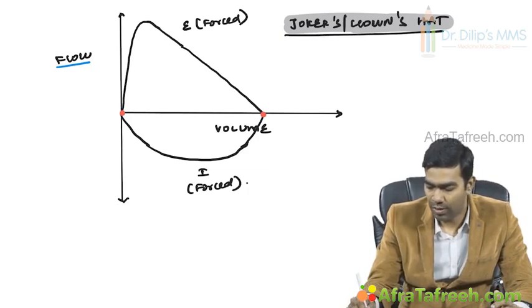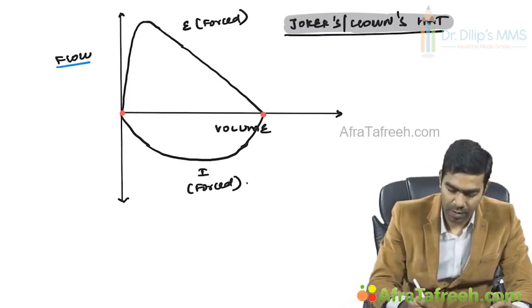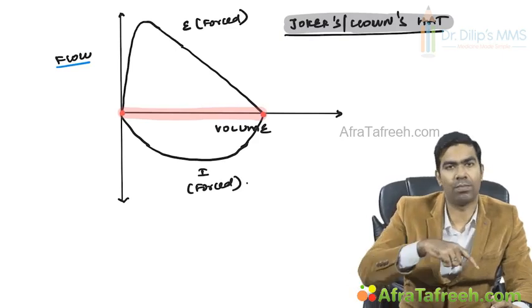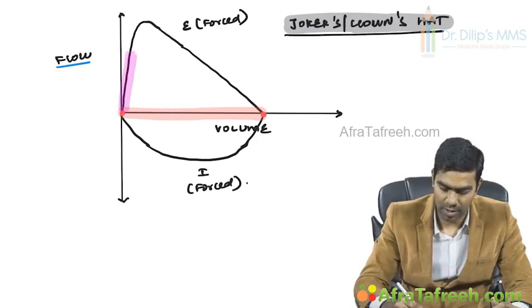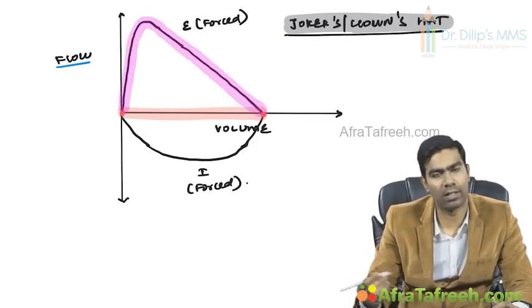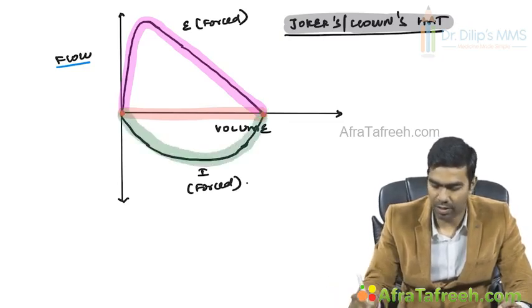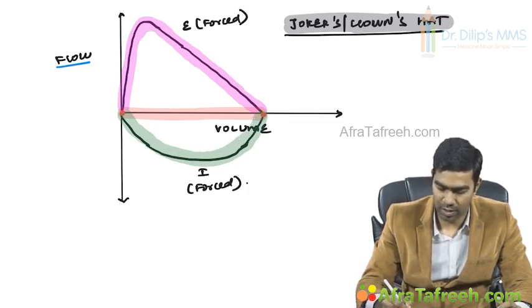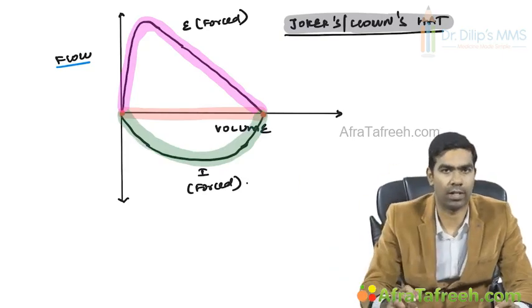And you can also see there are other indices that are important in a flow volume loop. The most important being this particular volume. You can see this is one cycle that starts from inspiration to, this is an expiratory cycle. Let us draw like this. This is an expiratory cycle. It ends in the completed expiration, and you are going to have an inspiratory cycle. Once again, you will get an expiratory cycle, and once again an inspiratory cycle. So expiration, inspiration, expiration, inspiration. You are going to get multiple curves like that.